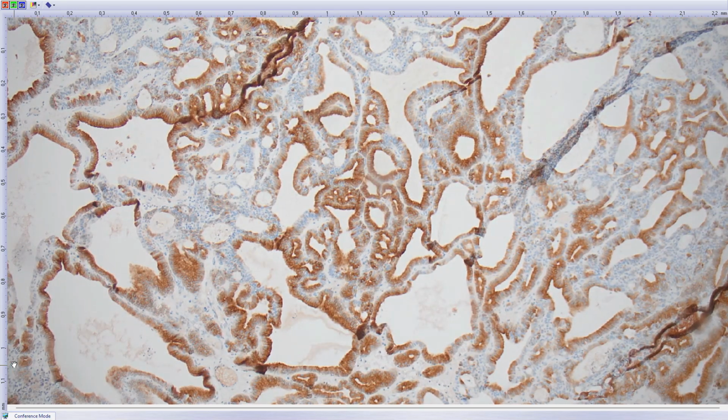Okay, and in case it shows high-grade dysplasia, it's very difficult to set the border from an in situ lesion to invasive carcinoma. But again, it's not that important because the prognosis is very, very good. Excellent case. Well, what is the best marker? You spoke about MUC, so which one? It will be, I believe, cytokeratin 20 and CDX2, these will be negative. And if you wish to perform mucin staining, mucin 6 is positive, but you may have patchy mucin or other mucins.